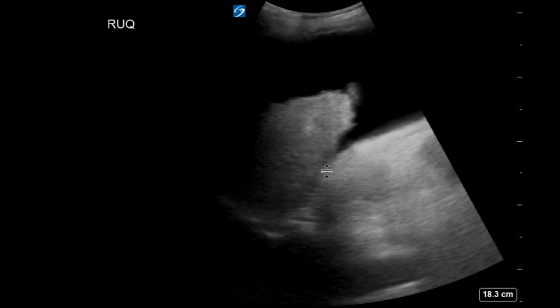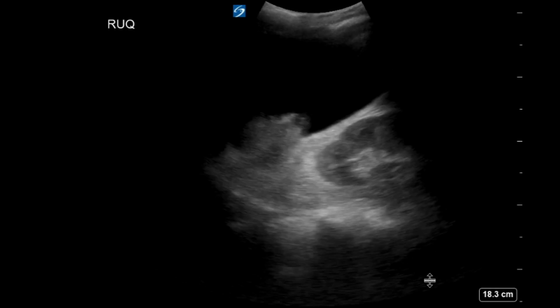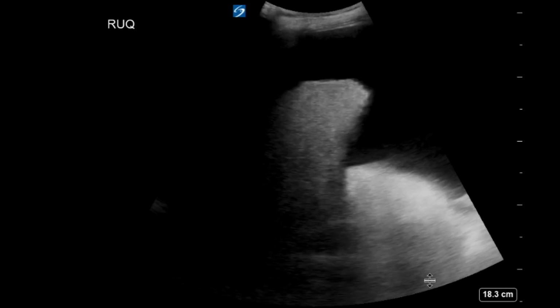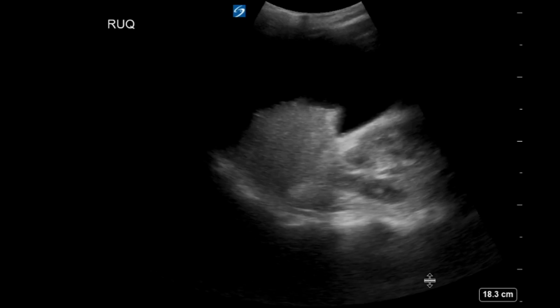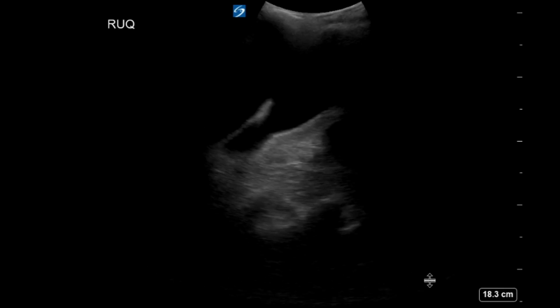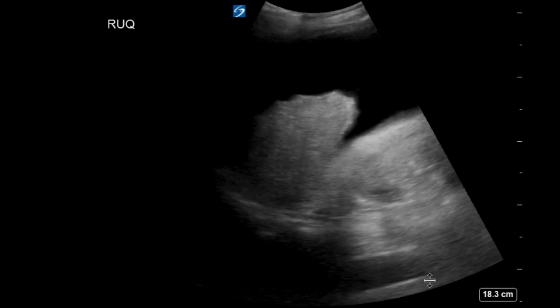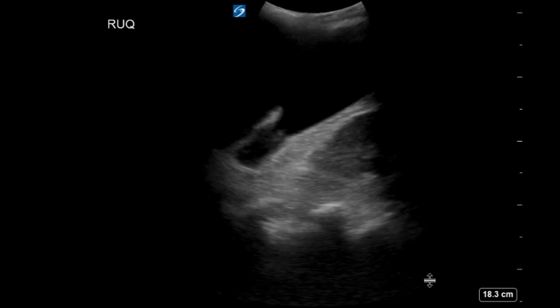Yeah, I don't necessarily. If I know a little bit about the patient's history, I would probably suspect ascitic fluid versus blood. Yeah. It can be hard to tell though, sometimes on an ultrasound, because they're both anechoic and you can't necessarily tell the difference between blood and ascites. But in the absence of trauma, this guy comes in and he says, I get paracentesis every week. This is likely more consistent with ascites, like you said.